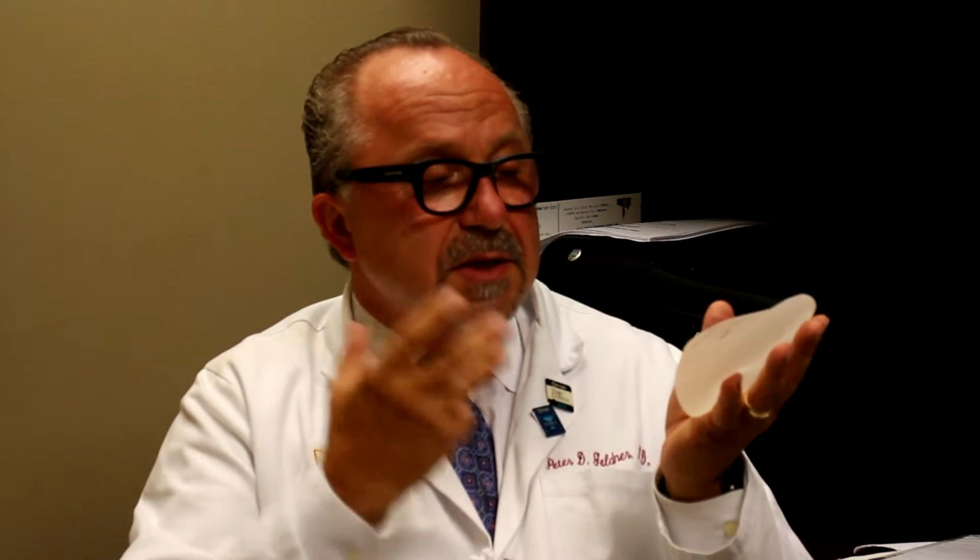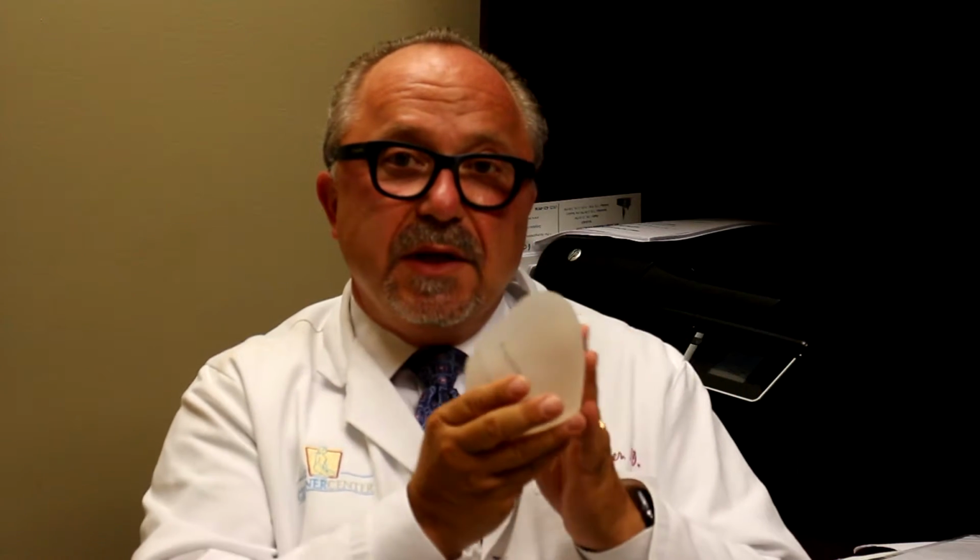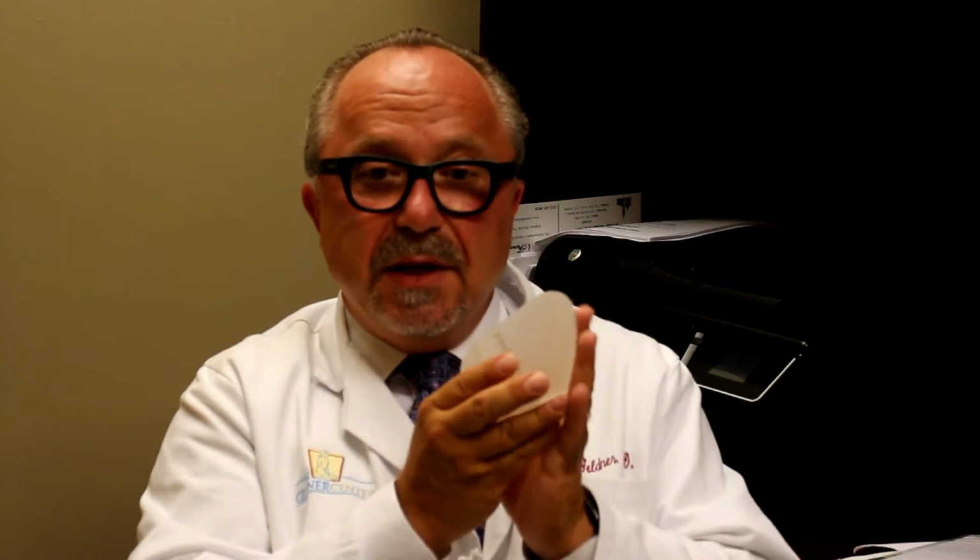So this means a few things. One of them is that if the patient has a breast that is very thin, whether we go under the muscle or over the muscle, we can use this kind of an implant, and it's going to leave the shape of the implant rather than relying on the shape of the breast. So it gives us a lot of abilities to actually create the shape that we want.